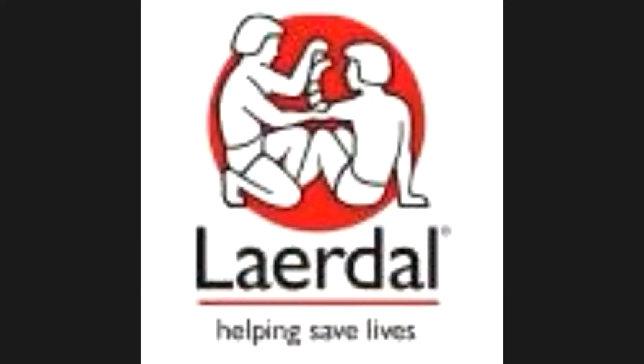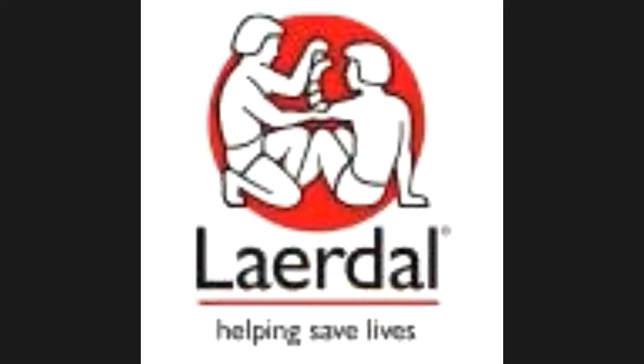We even have a solution, Shane, if you don't mind showing us, if you can't have any form of electric energy going through your SimLab: a simulated defib on the LEAP monitor that Shane can show us in a second. So I wouldn't say LiveShock or ShockLink, one is better than the other. We have different options for different products.